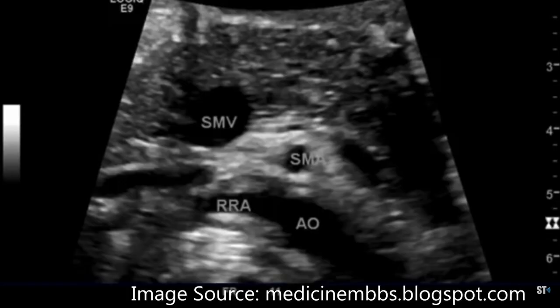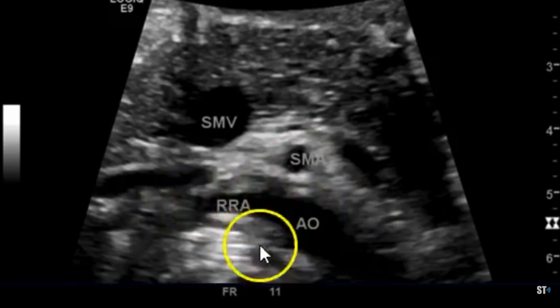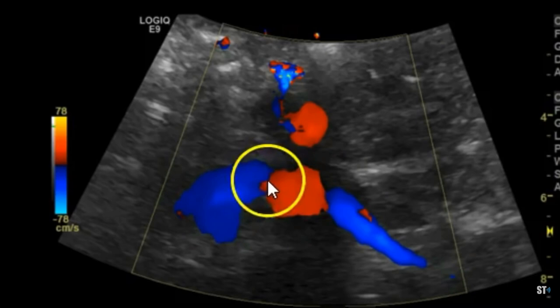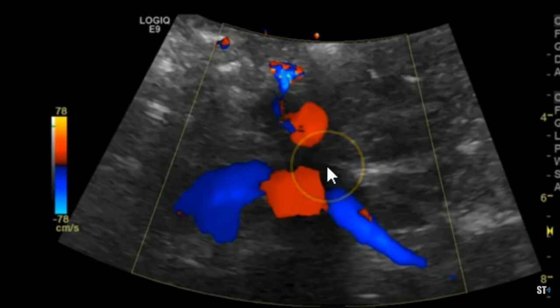Here's a transverse image. You can see the superior mesenteric artery, the aorta, and the right renal artery. The IVC here is kind of collapsed, but you see how the right renal artery courses behind the IVC. And here's a color Doppler image showing your aorta, right renal artery, and left renal artery. It's color encoded in blue because the blood flow is going away from your transducer face.